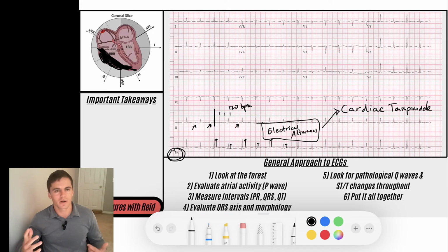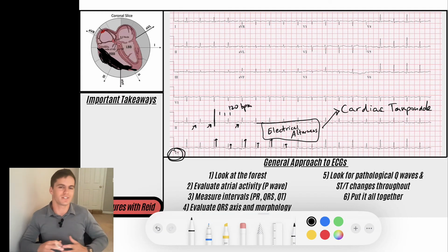And so that kind of rounds out our pericarditis discussion. Remember, pericarditis affects the pericardium. Remember that pericarditis affects phase 2 of that action potential, which is usually what allows for that ST segment to be nice and isoelectric and flat. But in this case, we get diffuse ST segment changes, we get ST elevation, we get some PR depression, we get the opposite changes in AVR. And so use the EKG as a tool in your diagnostics for pericarditis.